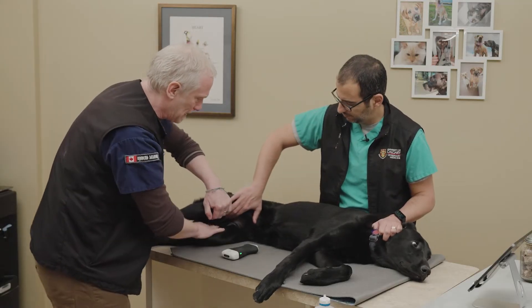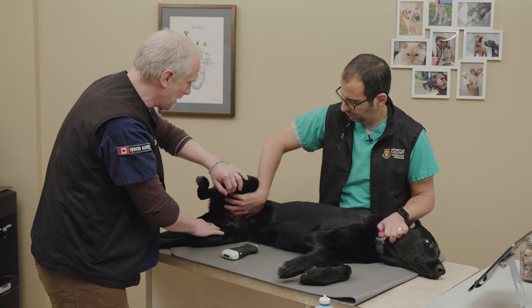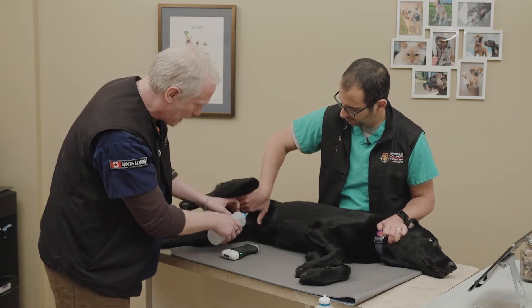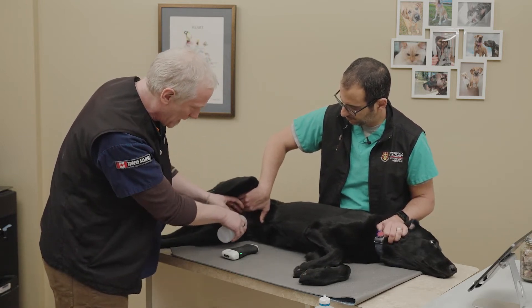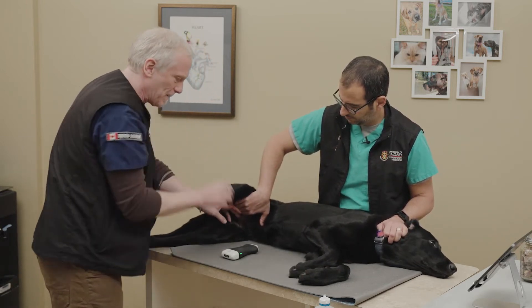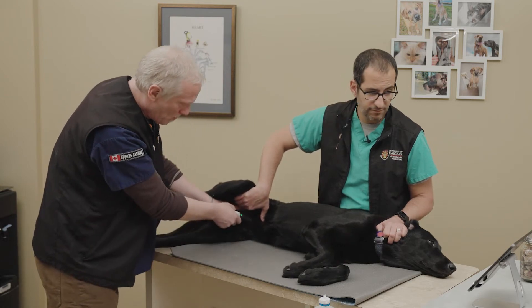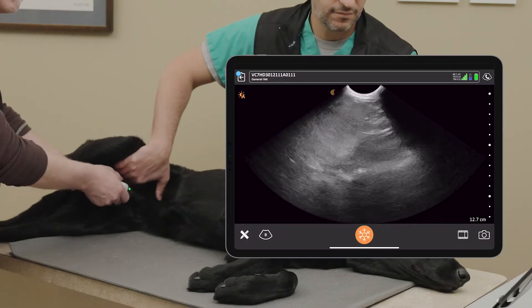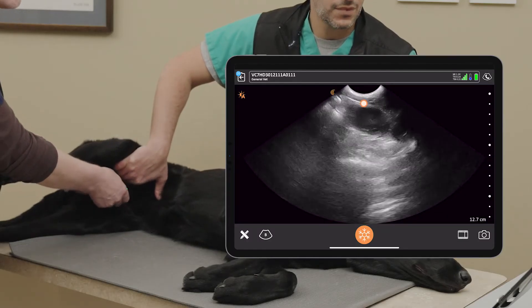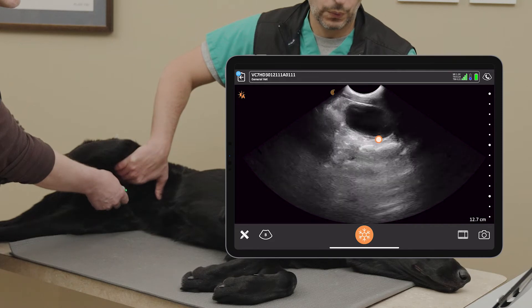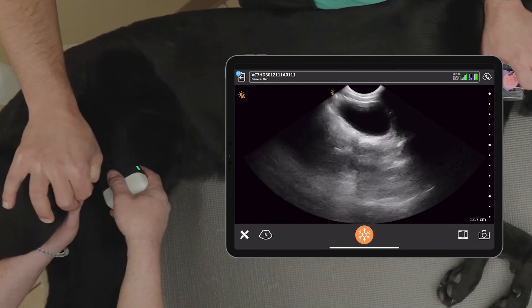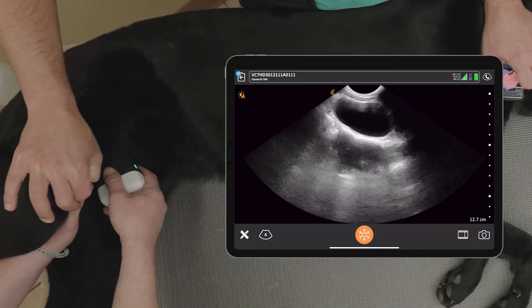Following the umbilical site, we lift the leg up a little bit and come back to get the urinary bladder site. We apply alcohol, separate the fur so we can see the skin, pop the probe in, find that urinary bladder, and scan that site.